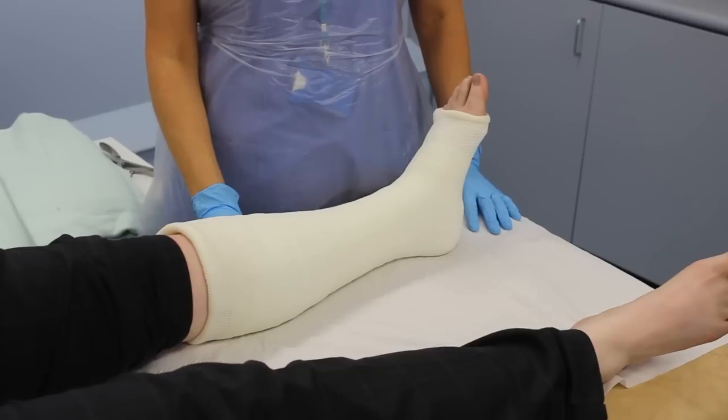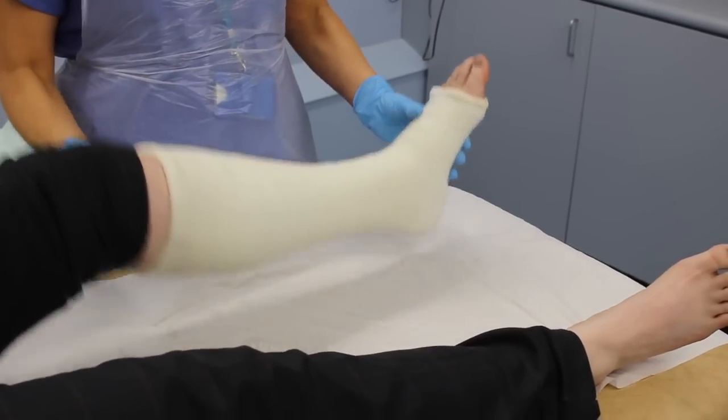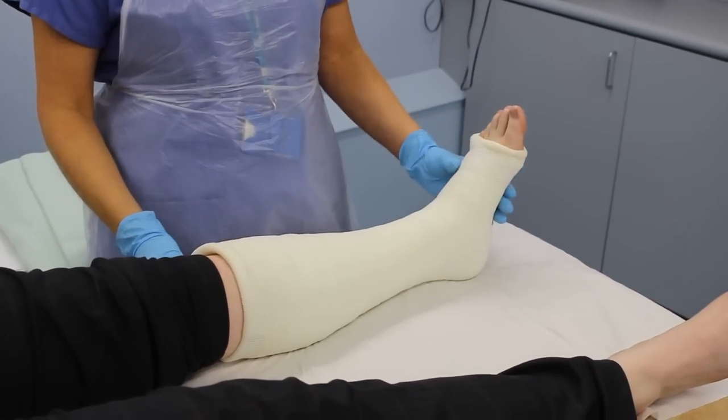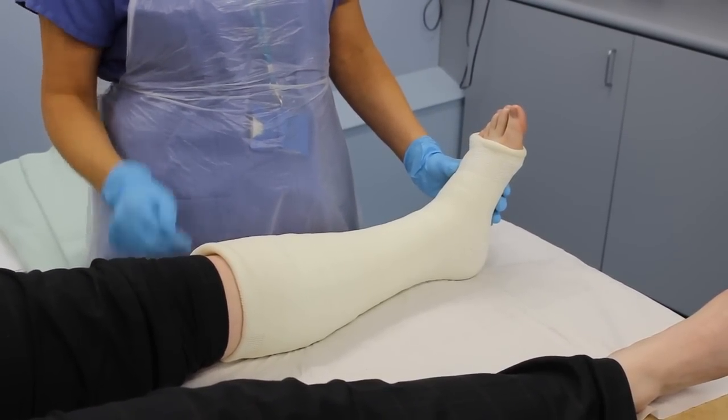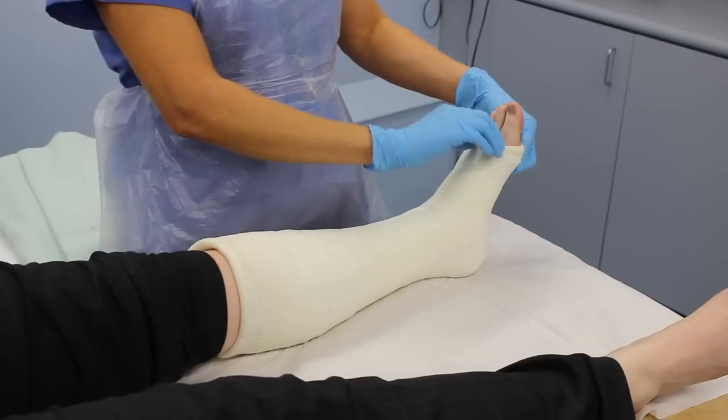Check that the length of the cast enables the person to move all joints not encased. Please observe whilst we check this. The cast should be well padded at both ends and no sharp edges can be felt, which may cause sores.